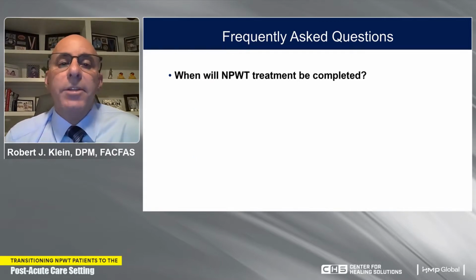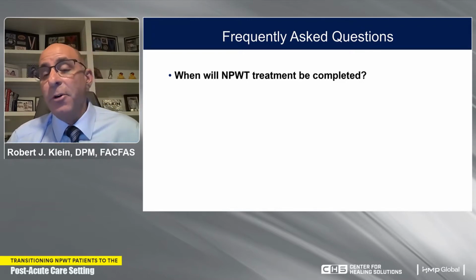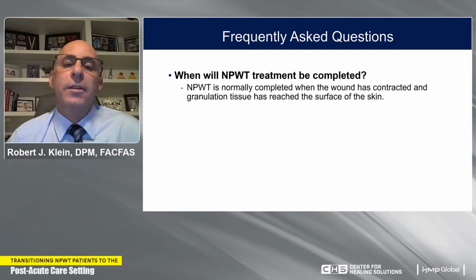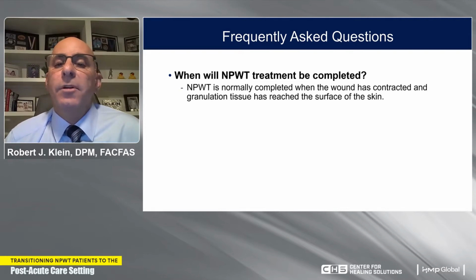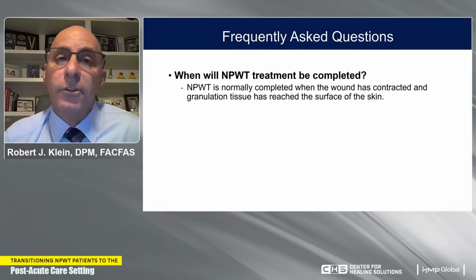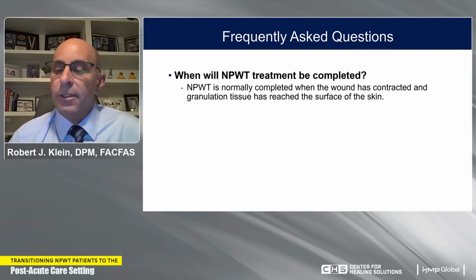Another question that my patients will ask is, when will negative pressure wound therapy be completed? And that's a really hard question. I tell them on average it's about 4 to 6 weeks, but the answer that I also tell them is that negative pressure wound therapy is completed when the wound has contracted and granulation tissue has reached the surface of the skin. But that's a real hard question to answer for the patient, because each wound is different and every patient heals a little bit differently.